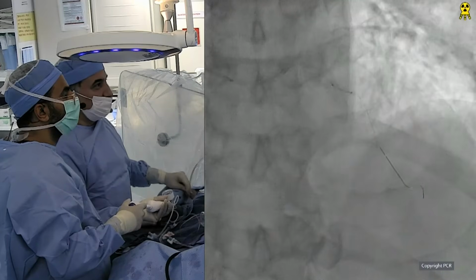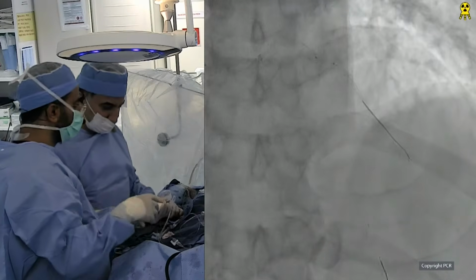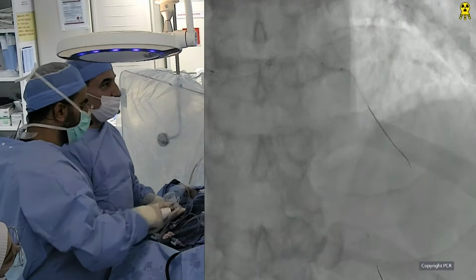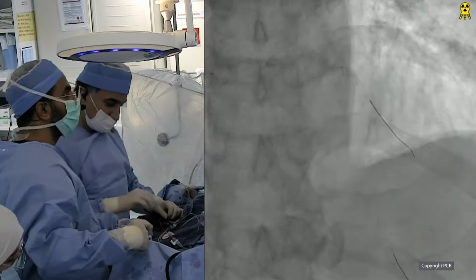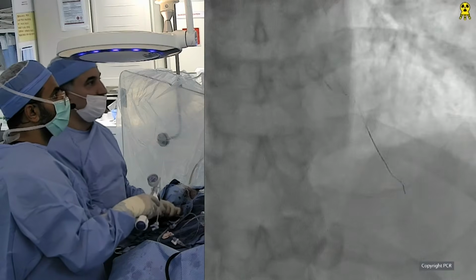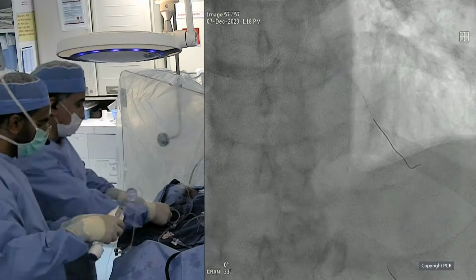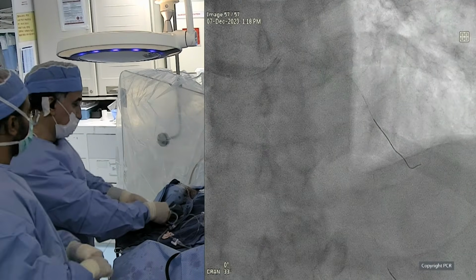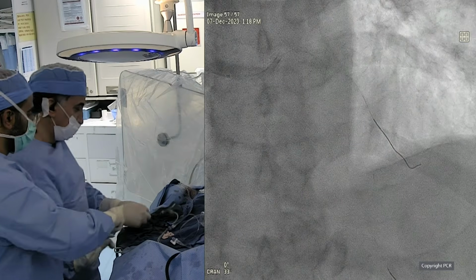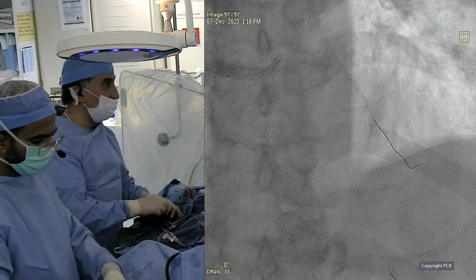They're trying to balloon. I mean, we watch you work, and I assume what you do is you put another anchor balloon in. Yeah, okay, no. I think we'll take a guideliner, or even with anchoring, I cannot move the stent. Yeah, now you're changing for a guideliner, which is not trivial if you have 2 wires down, right? We'll take the diagonal wire out.